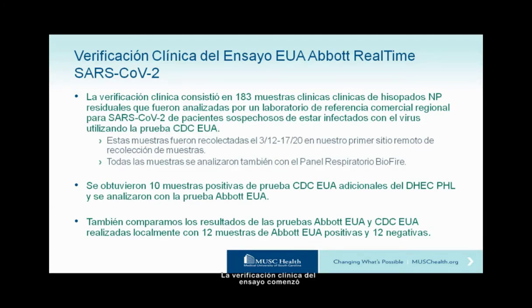The clinical verification of the assay started out with the residual clinical specimens that were collected during the early phases of our opening of our remote collection site. So they were collected from March 12th through 17. All of the specimens were sent to a regional commercial reference lab for testing by the CDC EUA assay. We tested the specimens locally with the BioFire respiratory panel as well.